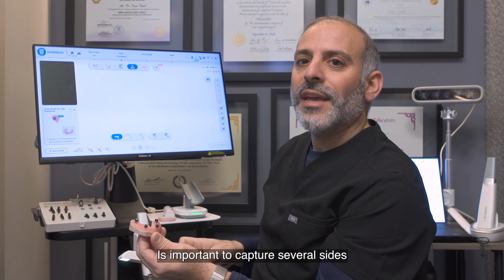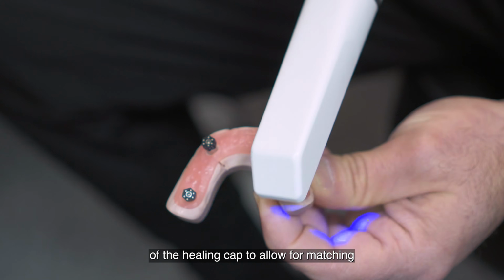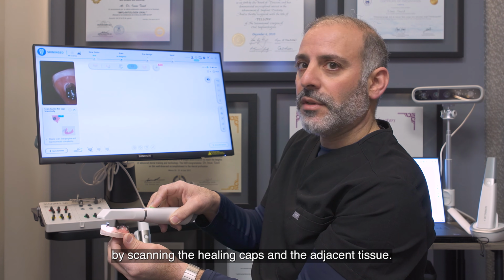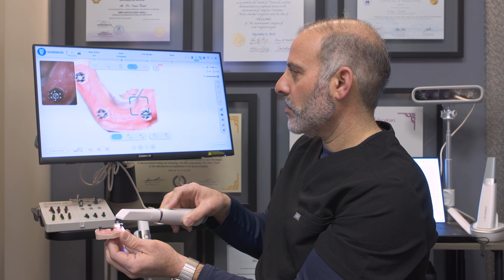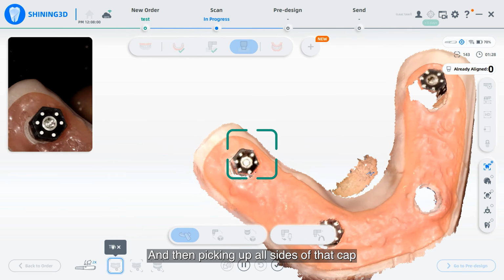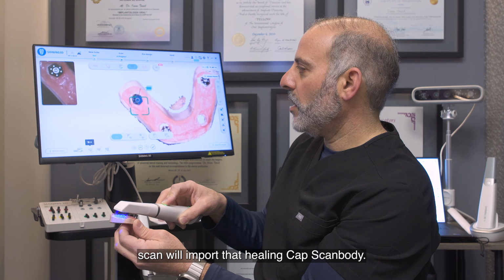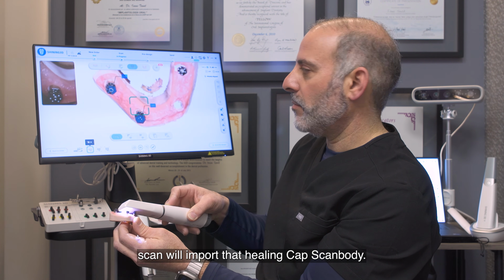It is important to capture several sides of the healing cap to allow for matching. Starting by scanning the healing caps and the adjacent tissue, and then picking up all sides of that cap scan will import that healing cap scan body.